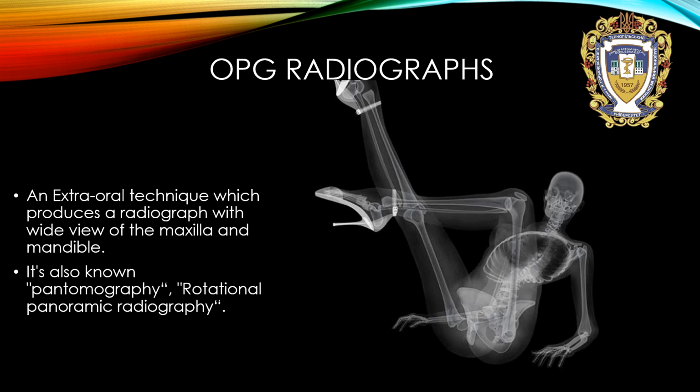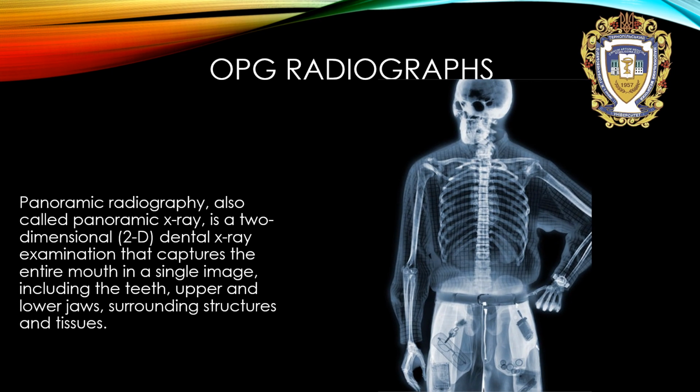It is an extraoral technique which produces a radiograph with wide view of the maxilla and mandible. It's also known as pantomography or rotational panoramic radiography. Panoramic radiography, also called panoramic X-ray, is a two-dimensional dental X-ray examination that captures the entire mouth in a single image, including the teeth, upper and lower jaws, surrounding structures and tissues.